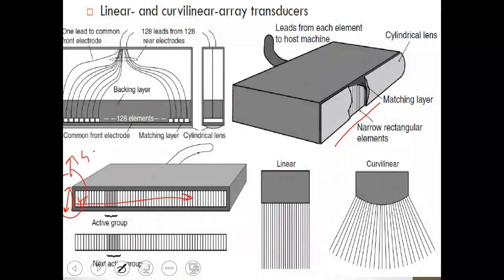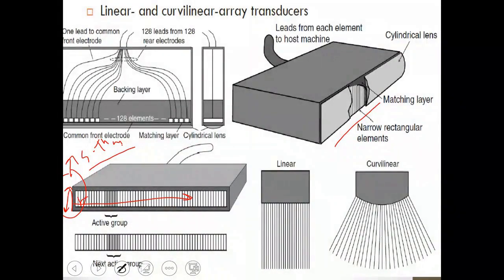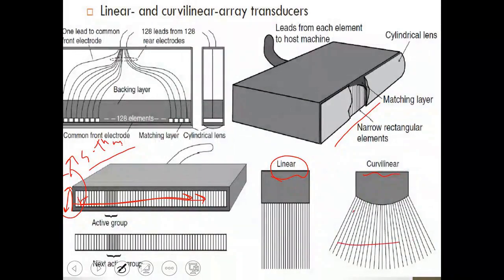Now this width, it's about what I call the probe itself, okay? This determines your field of view. In linear, it gives you a rectangular field of view, and in curved, linear, or convex, it provides a field of view that increases with depth.